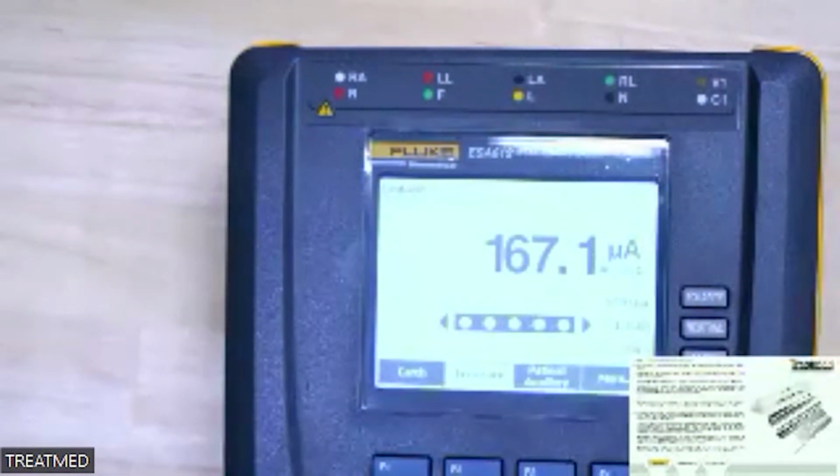And next, in this slide we show you when the applied part cannot be attached, for the electrical analyzer we use aluminum foil.